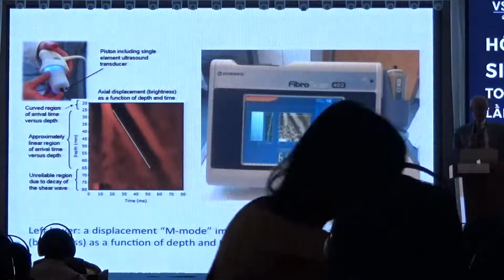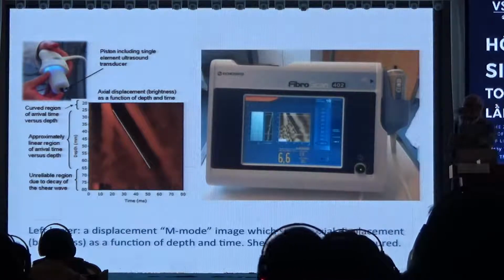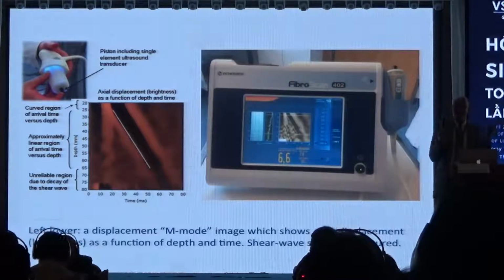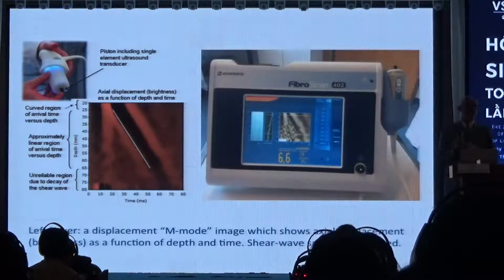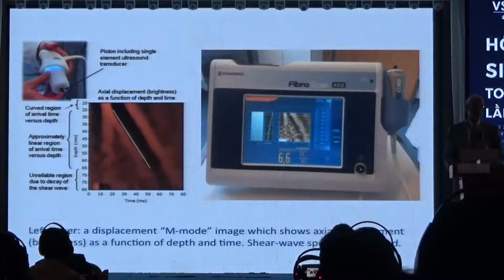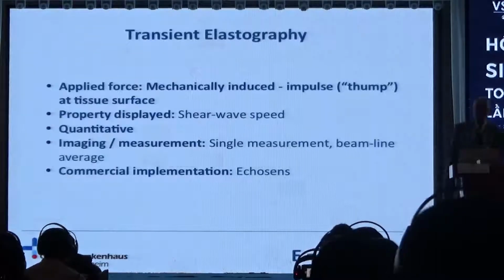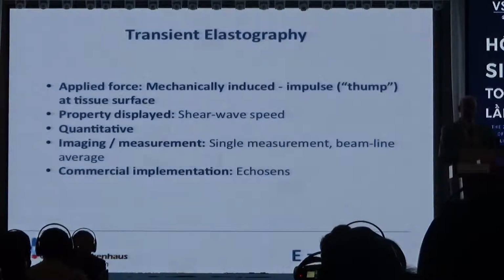All over the world, ultrasound in many countries is done by radiologists. And they were thinking about the market of hepatologists. Radiologists are bright, smart, intelligent, and so on. Hepatologists are stupid and uniform. So they made a machine where you have only to press a button, boom, boom, boom, and then you can measure liver stiffness. And they made that apparatus called FibroScan for hepatologists for a huge amount of money, and it was sold all over the world. And most studies, the most biopsy-proved studies, have been done by FibroScan. It is called transient elastography. Be sure, transient elastography is a shear wave elastography.